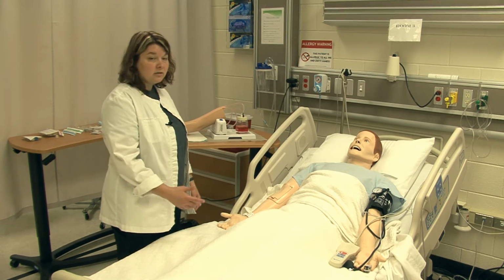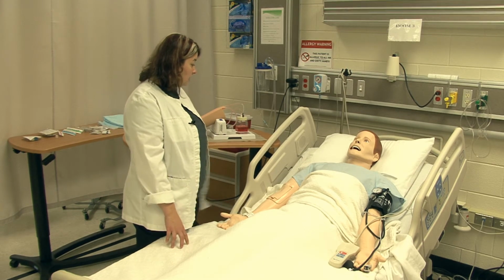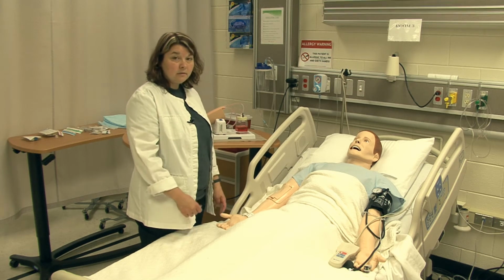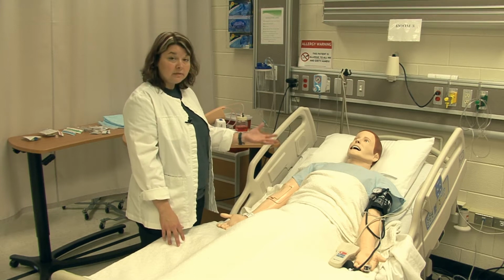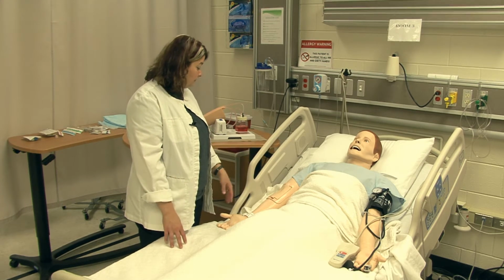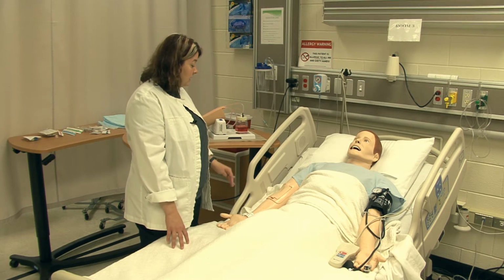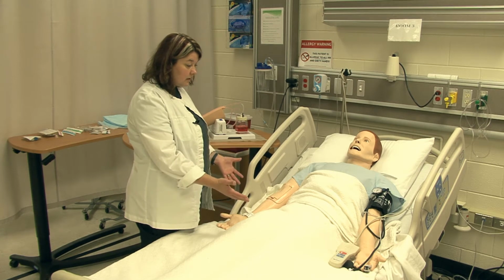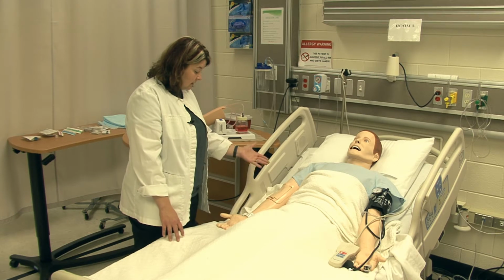You can also ask the patient's preference if they have a site that they prefer. Mr. Smith, do you have a preference for which arm your IV might be in? And then I need to also address any contraindications. So if he had a mastectomy, or if it was a lady, because fellas can have those as well. Also, if he had any dialysis shunts or grafts or anything like that. He tells me he does not have, he's never had any of those surgeries. He doesn't have any contraindications to that. He tells me that he would prefer to have his IV in his right arm.